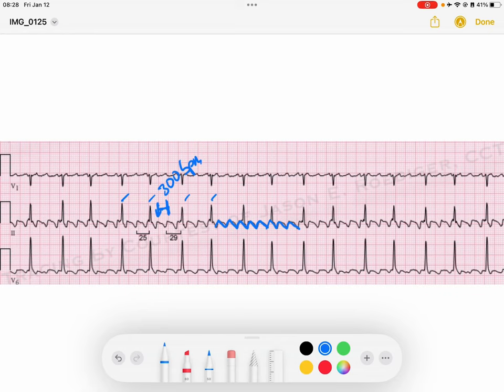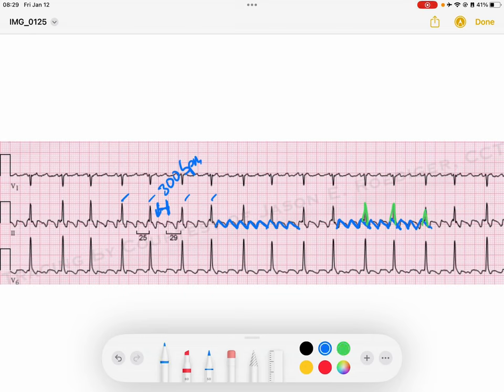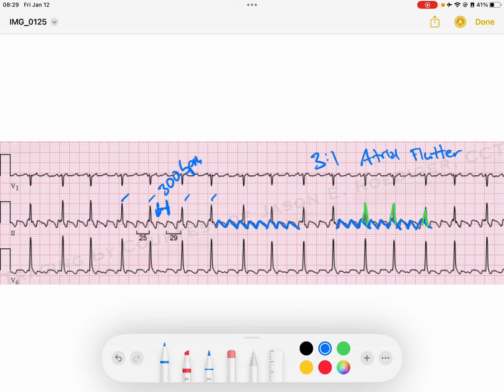Looking at the ventricular response, for every three flutter waves we get one QRS — then three more flutter waves, another QRS. This is what we would call three-to-one atrial flutter: for every three flutter waves, we are getting one QRS. Notice the QRS complexes are narrow because the AV node is conducting through the His-Purkinje system into our ventricular phase of depolarization.